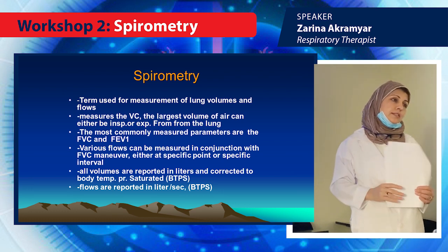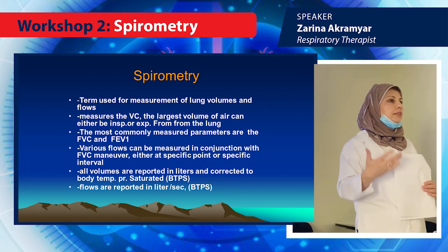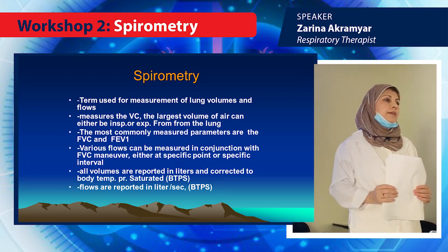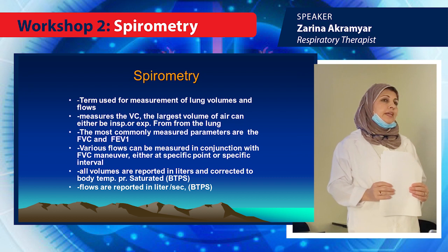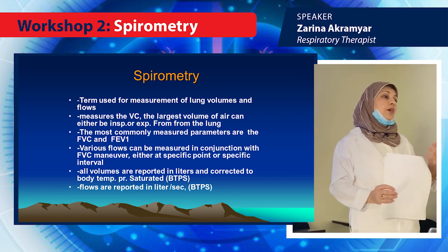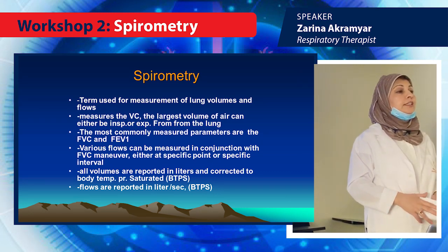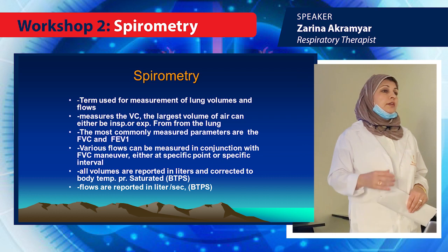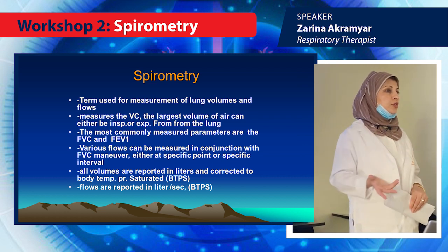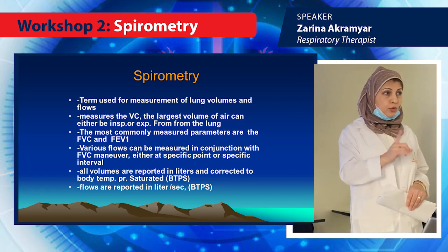And why are you doing it fast? I'm just asking simple questions so we can understand better. Because of obstruction? Yes, to differentiate between someone who is normal or someone who has obstruction. Because someone who has obstruction can never blow out all the volume of the air fast. So we are timing the blowing.